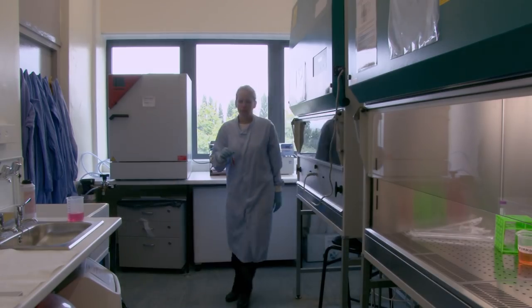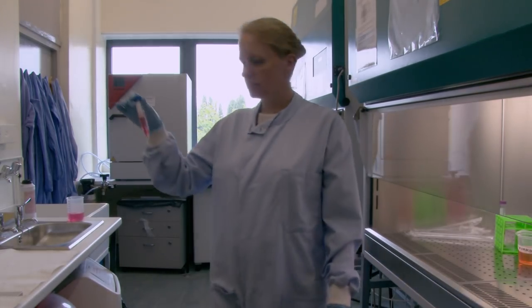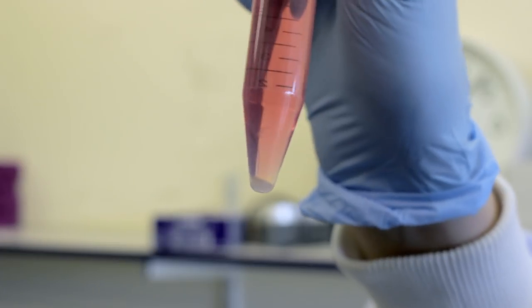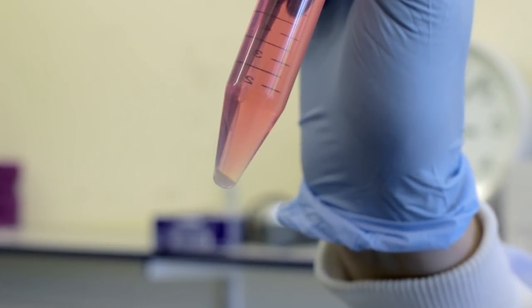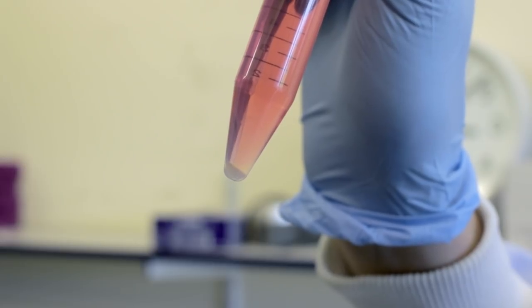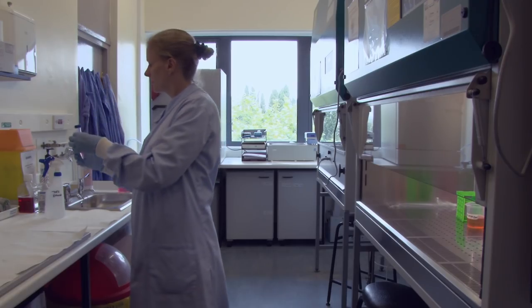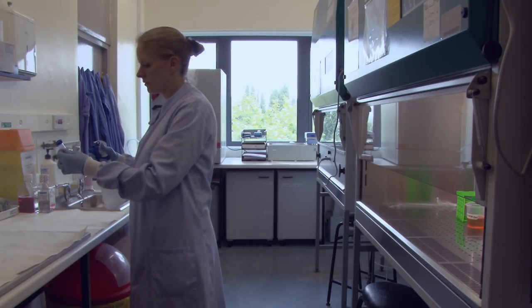Take the sample from the centrifuge and inspect it to ensure that the cells are in a pellet at the bottom. Sterilize it using ethanol before returning it to the cabinet.